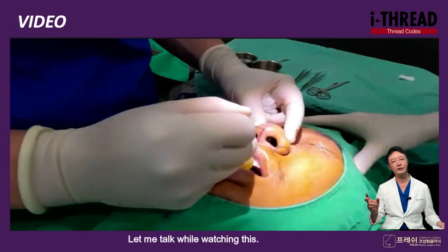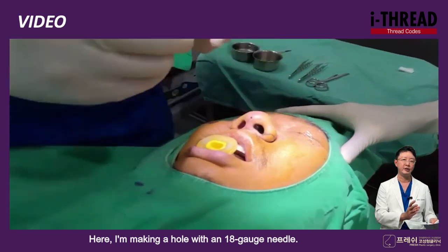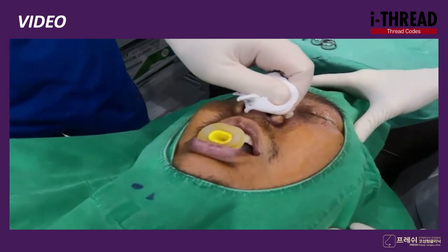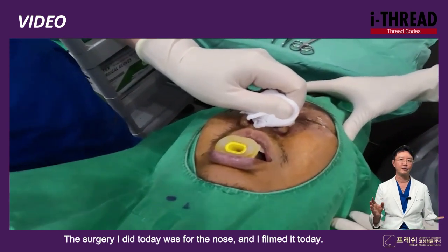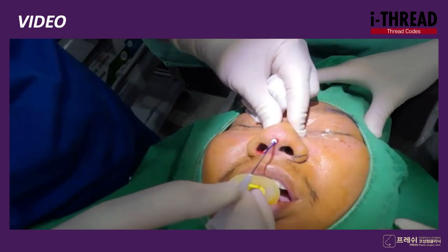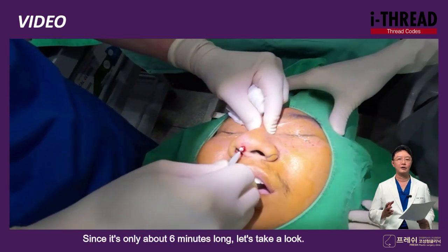Let me talk while watching this. Here, I'm making a hole with an 18-gauge needle. The surgery I did today was for the nose, and I filmed it today. Since it's only about 6 minutes long, let's take a look.